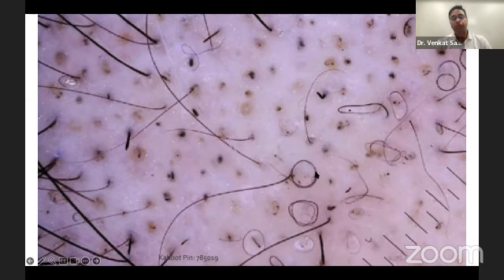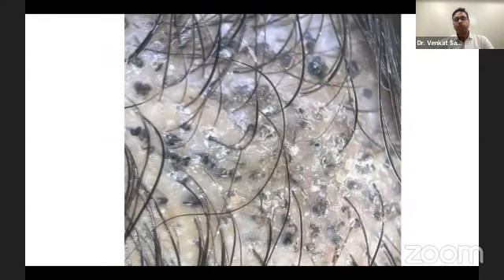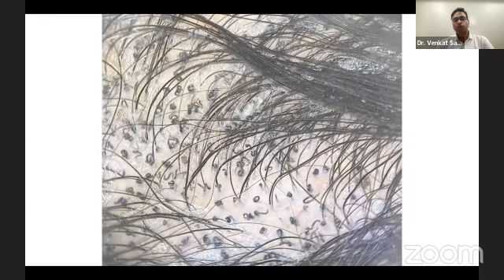These are supposed to be very specific for alopecia areata. Some of these may look like pigtails, as in this case here. So pigtail hairs, coiled hairs, black dots, broken hairs, exclamation marks, some of them, alopecia areata. If you've got these corkscrew hairs, then you're thinking about tinea capitis, especially in a 6-year-old with erythema and scaling.